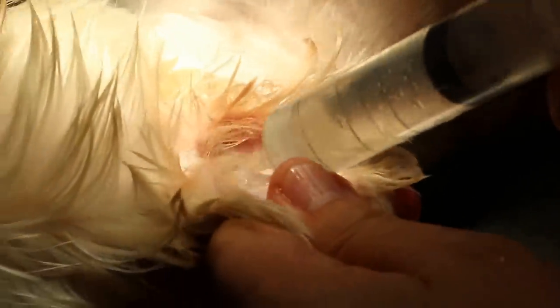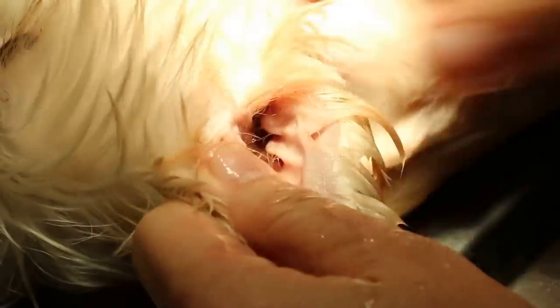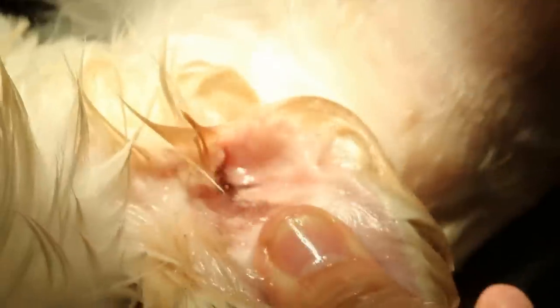Now I have to do the outside. Always position yourself correctly for the irrigation — otherwise you can't do a good job and you'll just work inefficiently. So I come to this side, and the video camera should come this side too. This one is definitely very dirty. Now 45 degrees. Only a slight bit of dirt came up because the groomer got a little. One ear has more dirt than the other. Now the sedation doesn't last forever — it will last about 15 minutes.